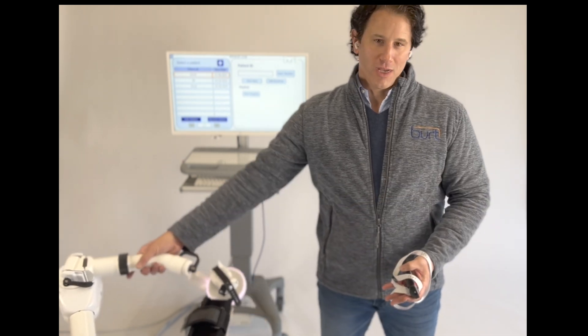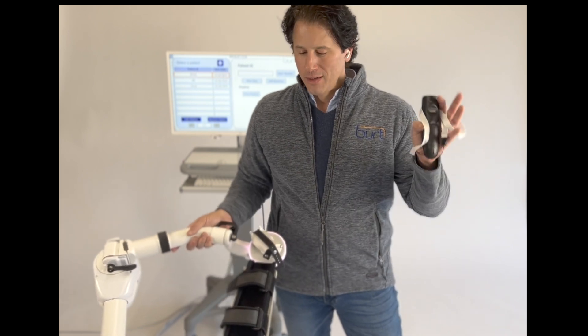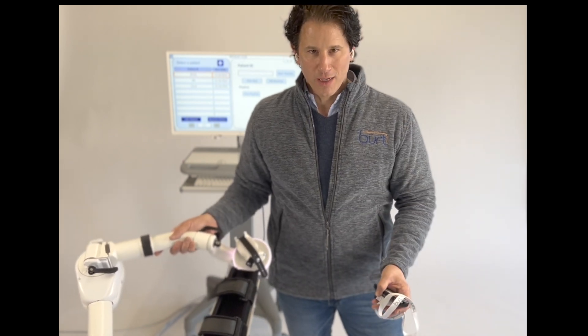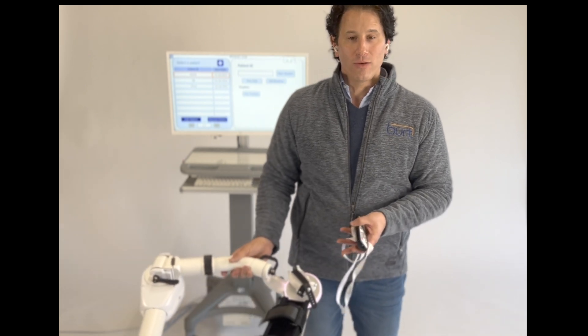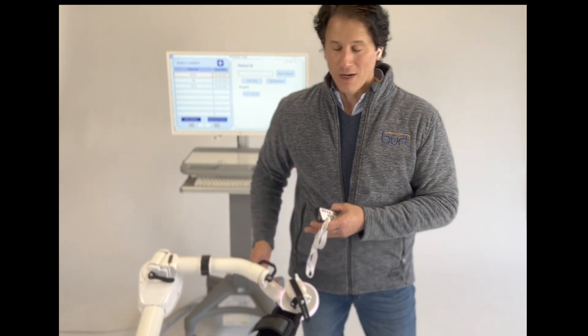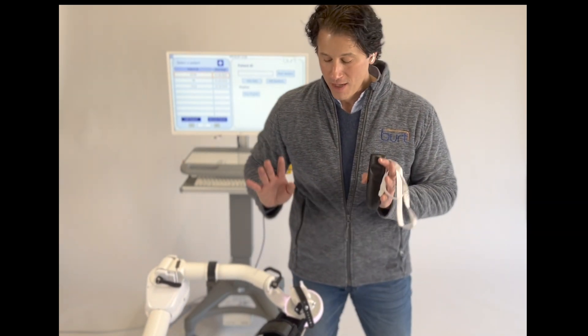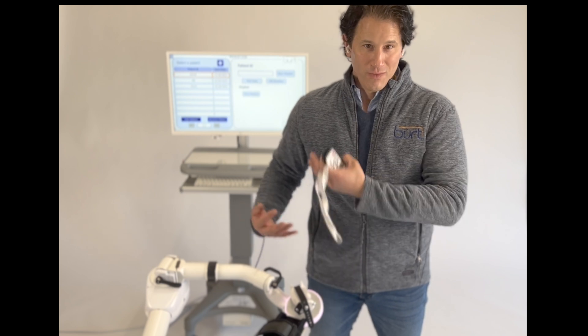The WAM arm is back-drivable, which is a key feature — it means it's safe. You can move it around. The only arm you have to worry about is the human arm that's in the Burt. You don't have to worry about Burt itself. It's not going to hurt you, it's not going to jerk you around. It's very, very considerate to our human bodies.